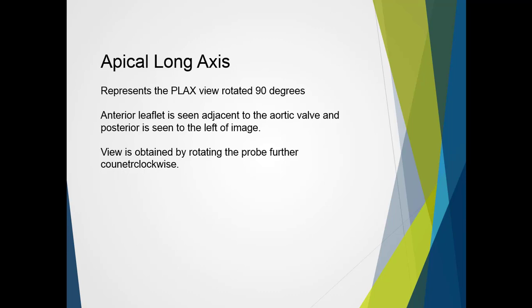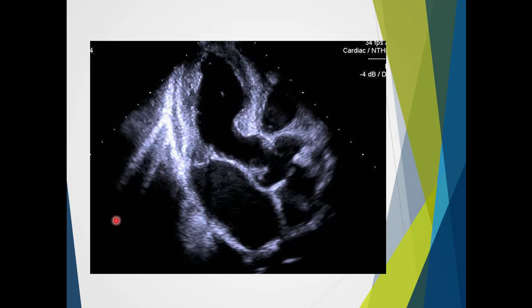Moving along, we come to the apical long axis view. This basically represents the parasternal long axis rotated 90 degrees, so instead of the heart being horizontal, it is now vertical in the image. The anterior leaflet is seen adjacent to the aortic valve, and the posterior is seen to the left of the image. This view is best obtained by simply rotating the probe further counterclockwise in the apical window. We can see the posterior leaflet and then the anterior leaflet clearly.